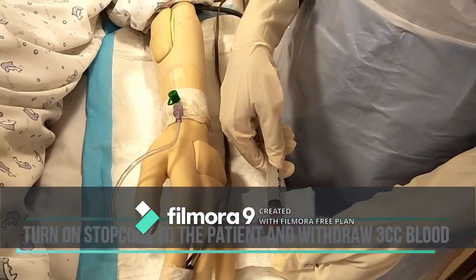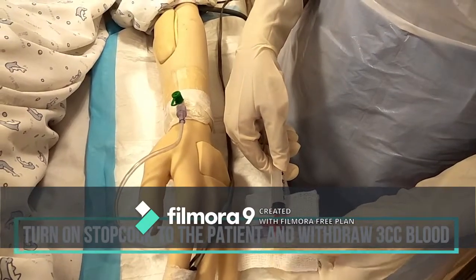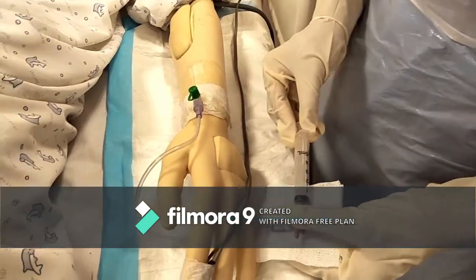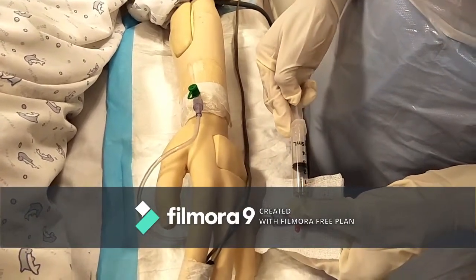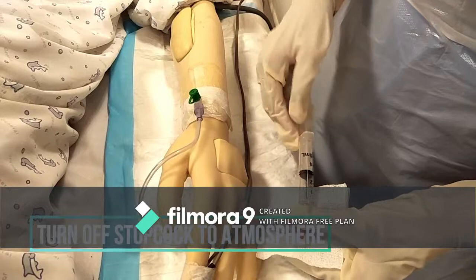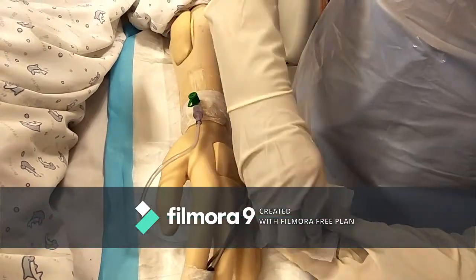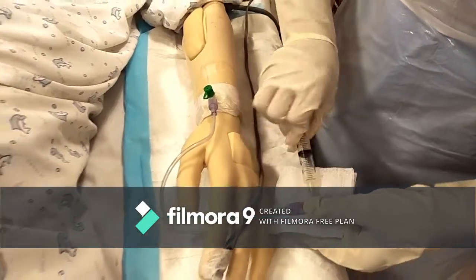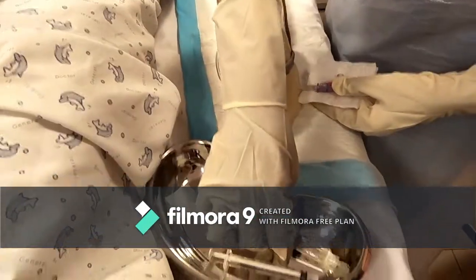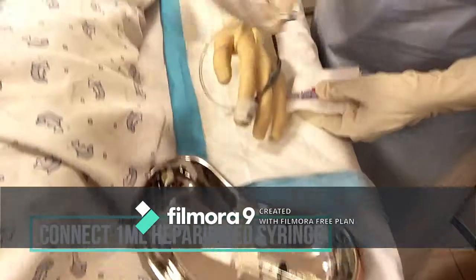Turn on the stopcock to the patient and withdraw the blood from the arterial line, approximately 3 cc. Turn off the stopcock. Remove the 5 cc syringe. Then connect the 1 ml heparinized syringe.